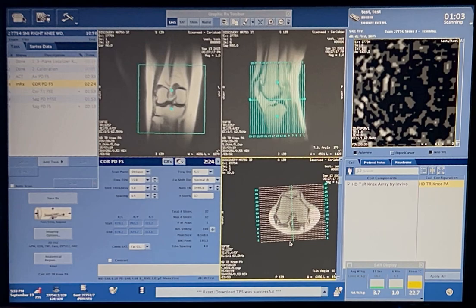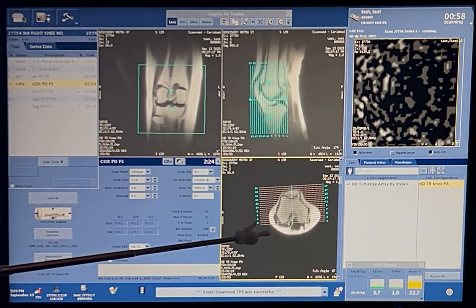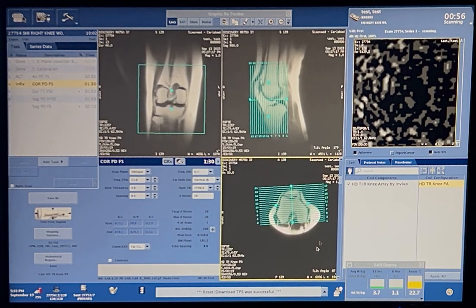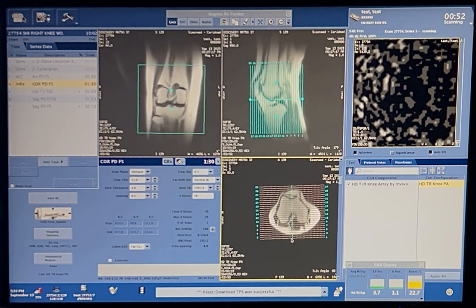That's pretty good. Go back. Keep going. Back to where one more. I'd angle it slightly to the right. You can see a little bit right there. And yeah, okay. Sorry, that's just my OCD.